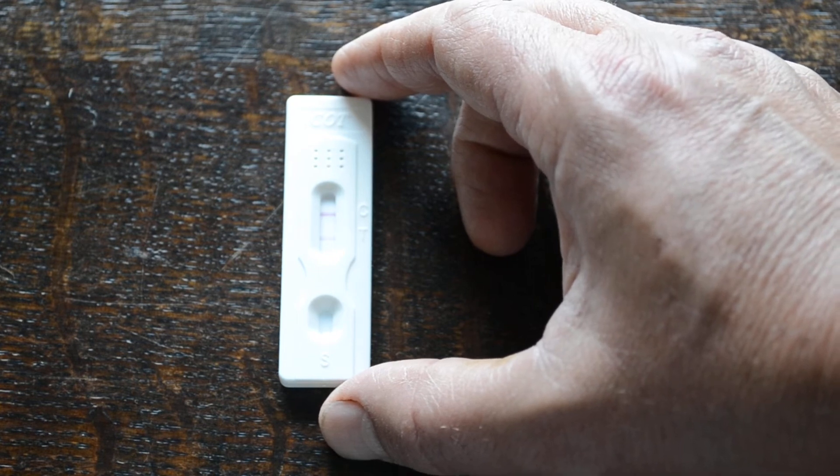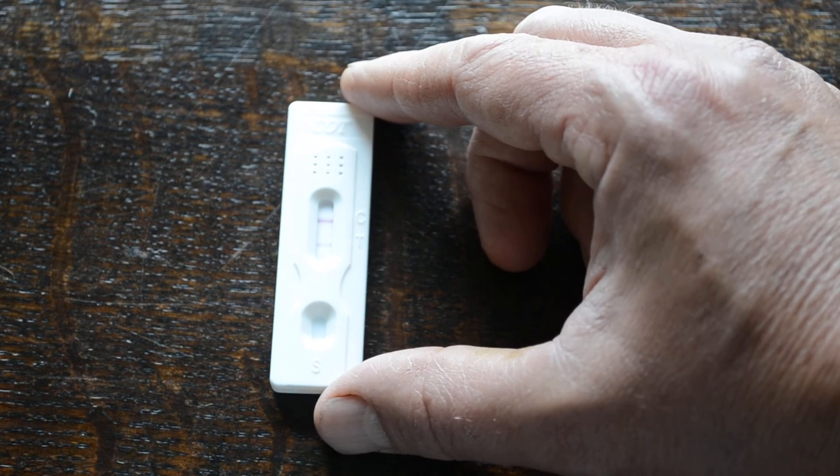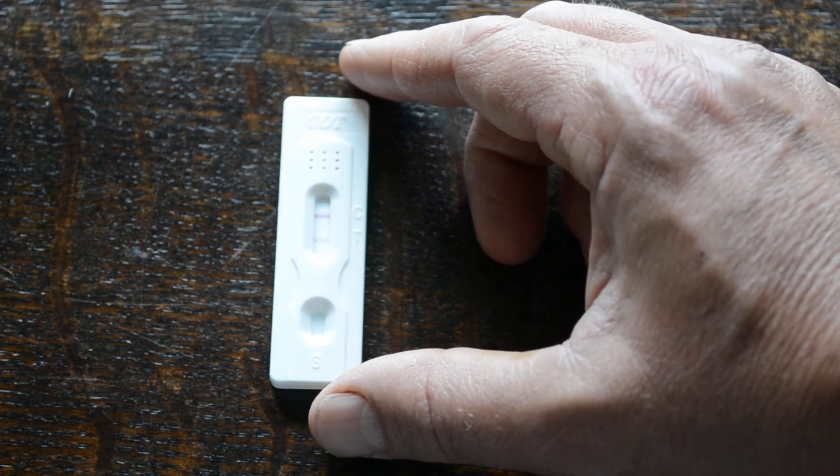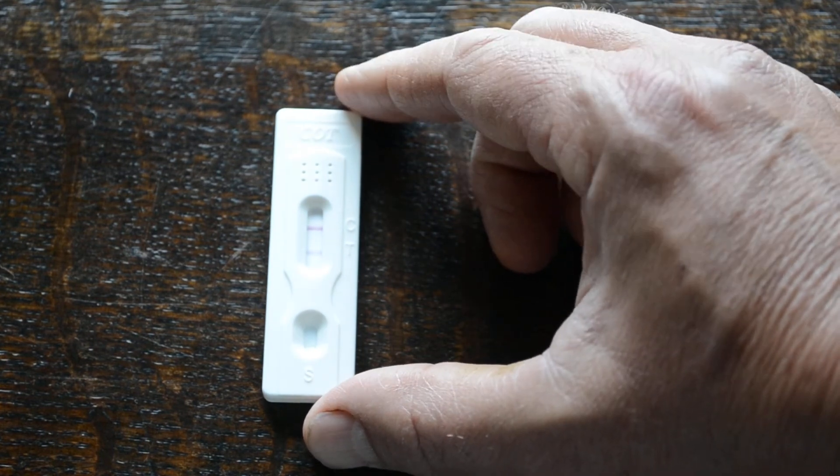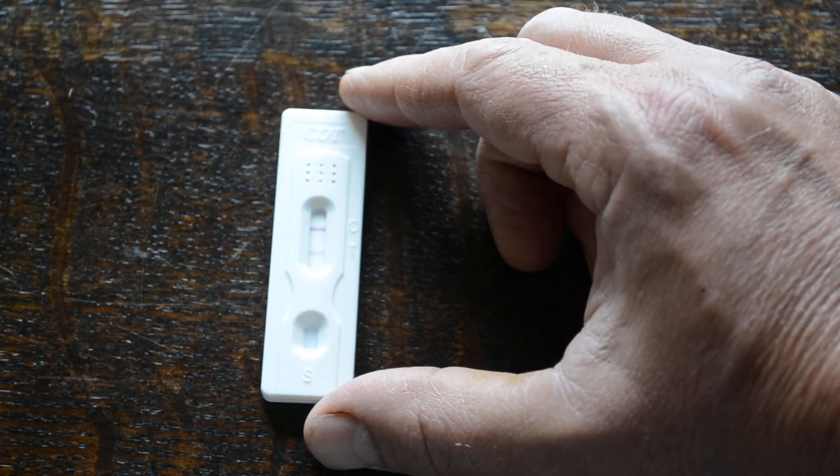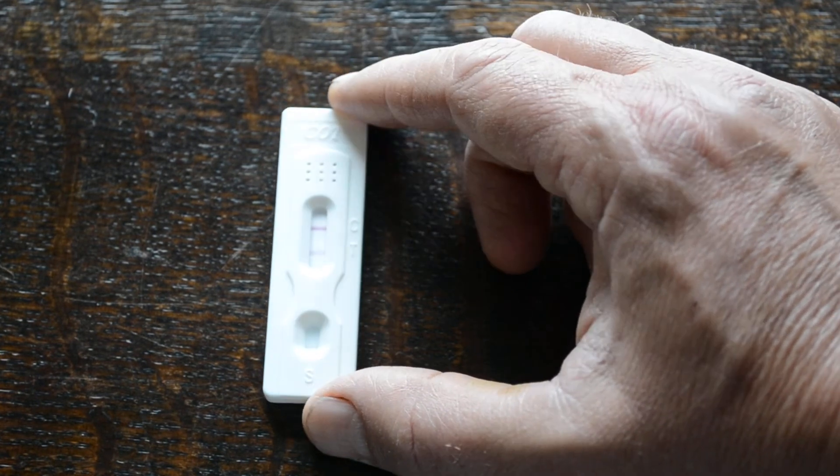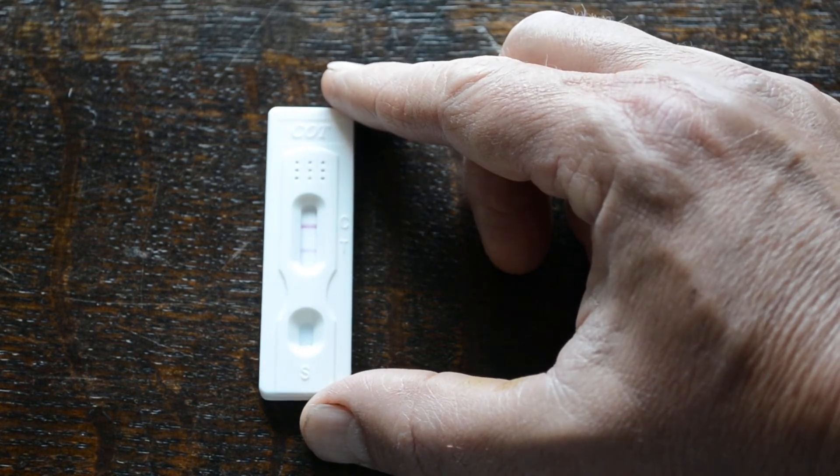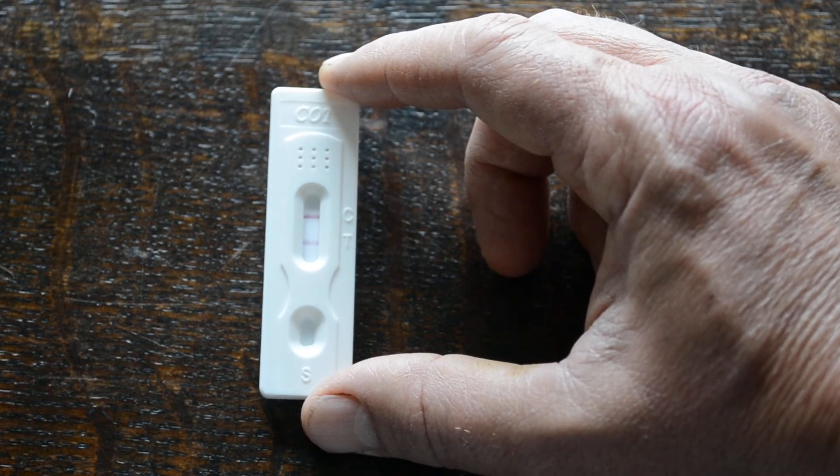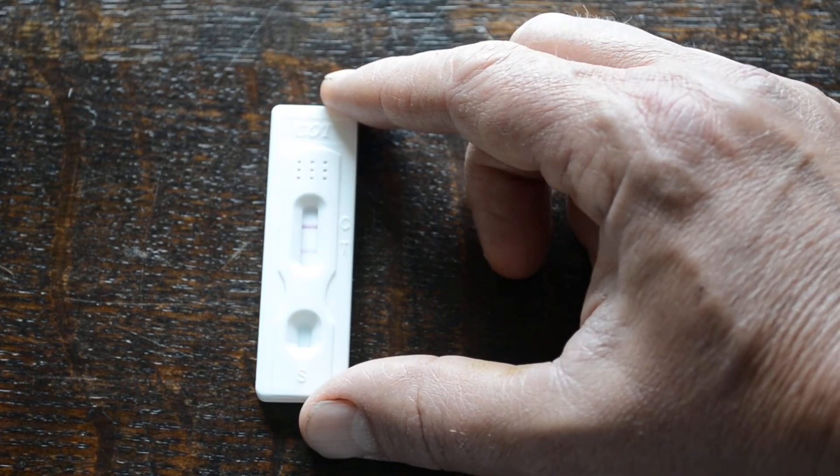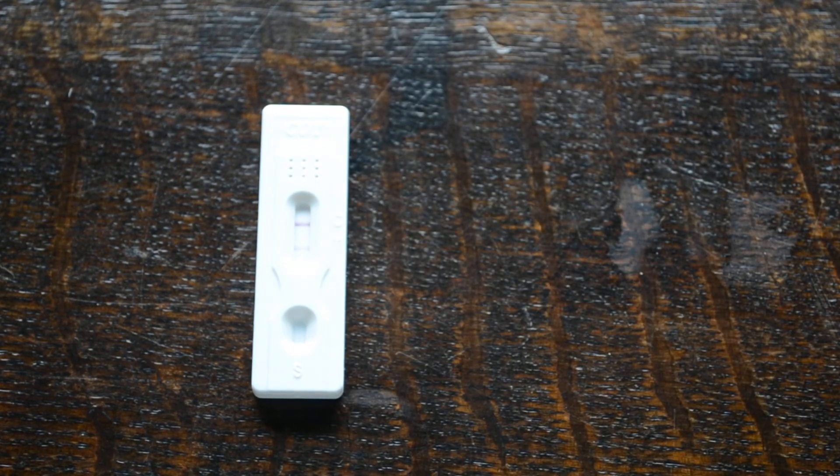So a very nice, simple, easy, and reliable quick check for smoking. These are used extensively in occupational health and insurance medicals where people are claiming to not be smokers. People aren't being told necessarily their urine will be screened for this, but you have the ability with this to detect if somebody's inhaled cigarette smoke in the last two to three days.